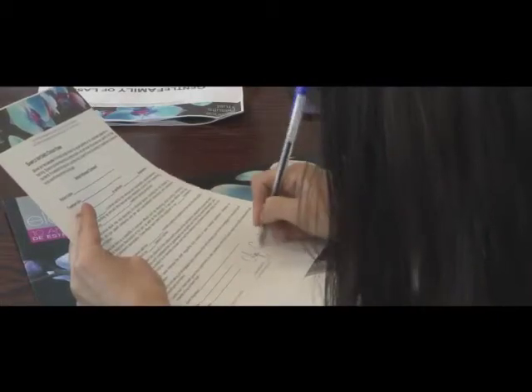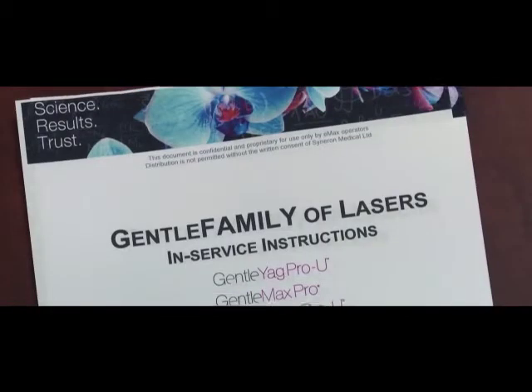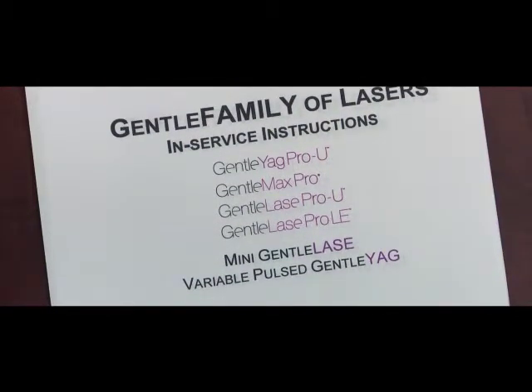Pre-treatment preparations, such as advice regarding sun exposure and post-treatment care, should also be considered and discussed. Please refer to the clinical manual and in-service instructions for a complete discussion of these items.